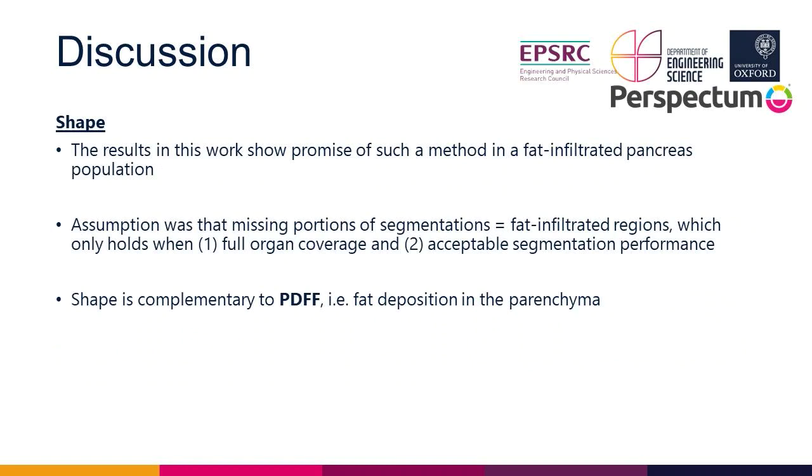The results of this work with regards to shape show promise of such a pipeline in a fat-infiltrated pancreas population. We worked here under the assumption that missing portions of segmentations were equivalent to fat-infiltrated regions, but this only holds when we have full organ coverage and also acceptable segmentation performance. We think that shape is complementary as a biomarker to proton density fat fraction, which reflects fat deposition in the parenchyma.